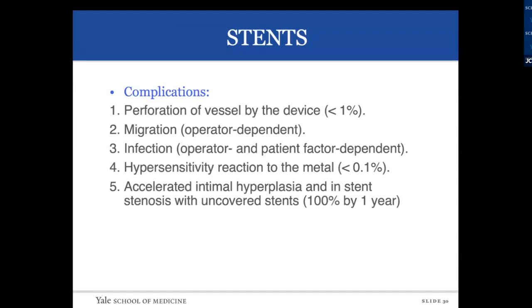The other parts are a little bit different. I have seen perforation when they're trying to place a stent if they do something different, but the majority of the time, an undersized or oversized stent is the problem.